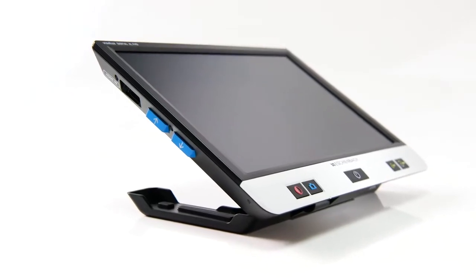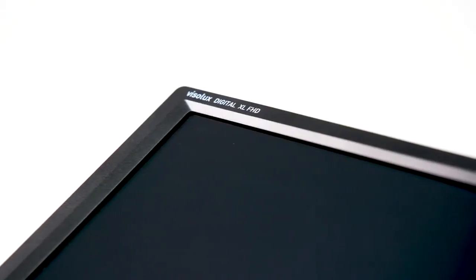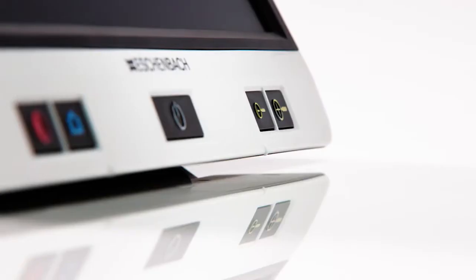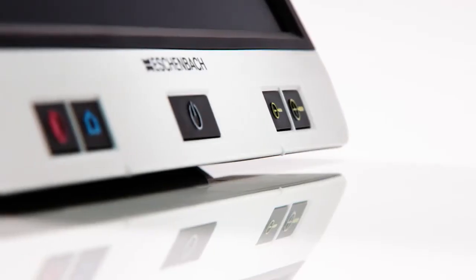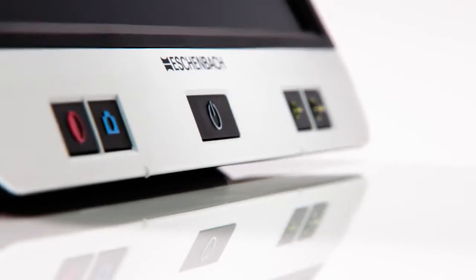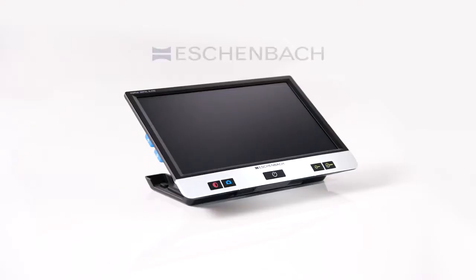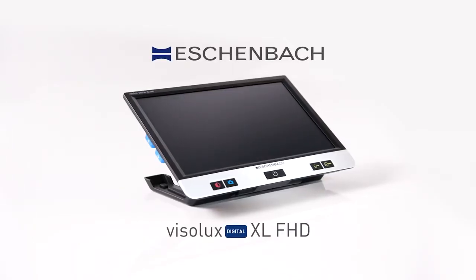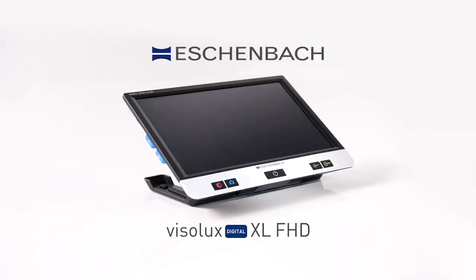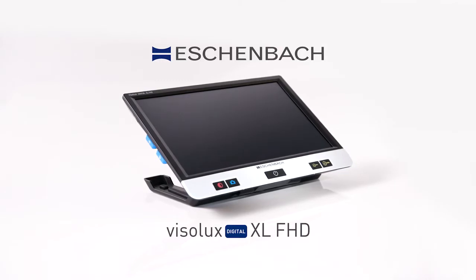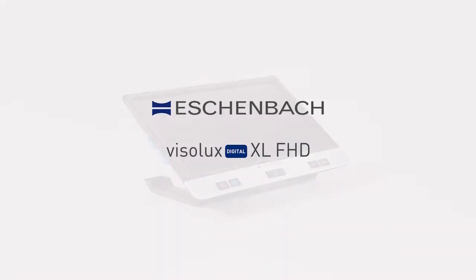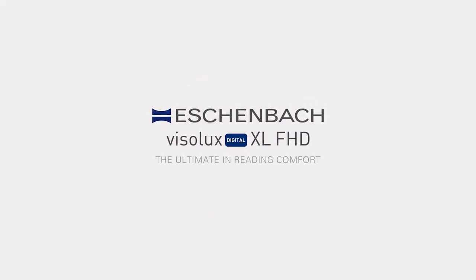The Visolux Digital XL FHD combines user-friendly features and intuitive operability with the large field of view of a 12-inch display. For the best reading comfort at home, work and school.